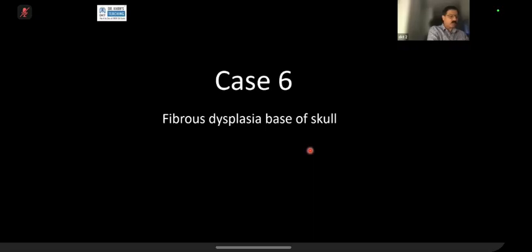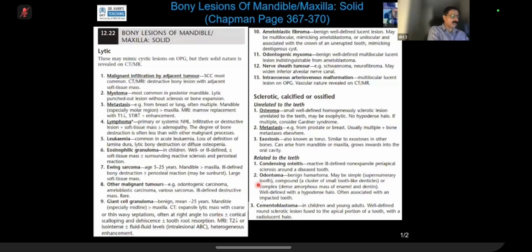So I have got quite a few slides to show you, and this will be classical potpourri, and I'm sure you will learn from this. Maybe if I had time, I should have put Paget's disease with it, but next time maybe I'll tell you more about Paget's disease. Now the key thing is I recommend that you go to your Chapman and read this one. Fibrous dysplasia, of course, can be polyostotic, monoostotic. In head and neck, chapter 12.22, it can be in the facial bones.